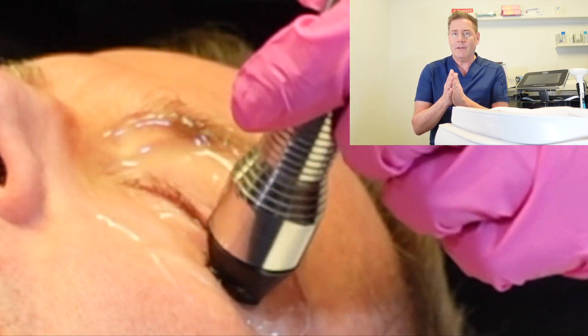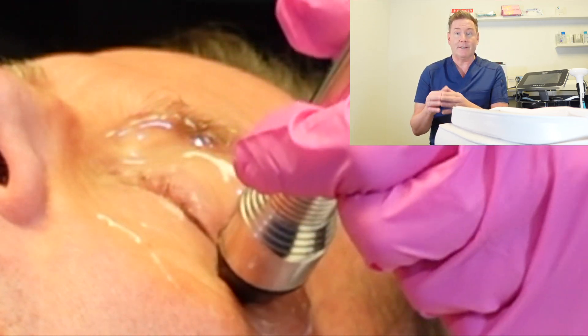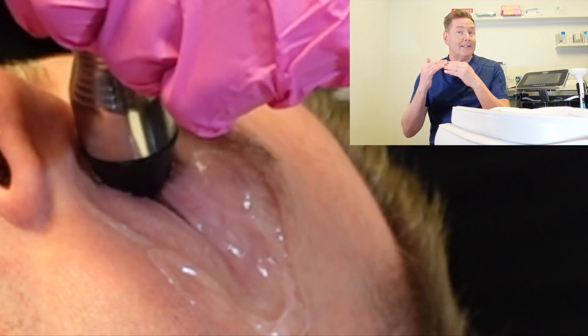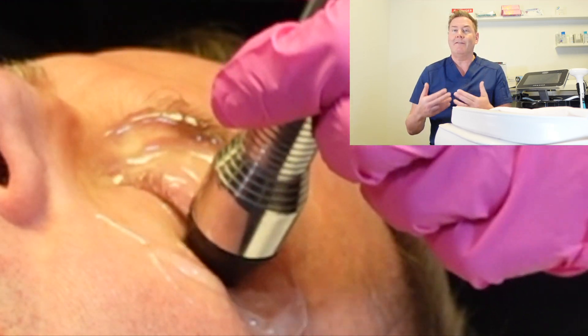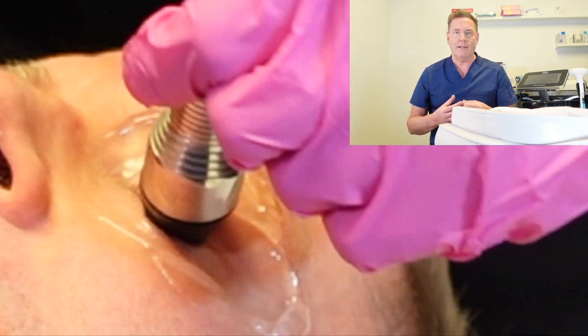Usually the target range the doctor is aiming for is somewhere between 40 and 43 degrees Celsius — that's the optimal temperature to treat your dry eye disease. And because it has a maximum temperature, it can never get hot enough to burn or cause any injury to your eyelid or the skin.